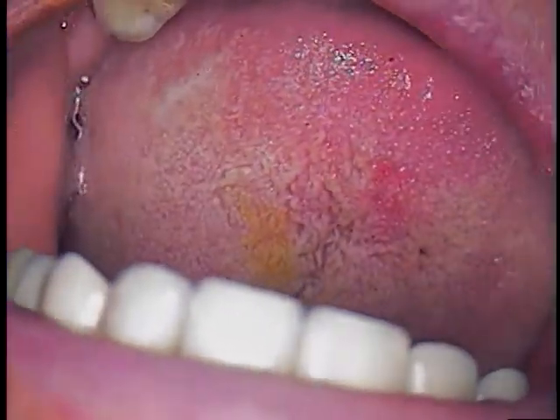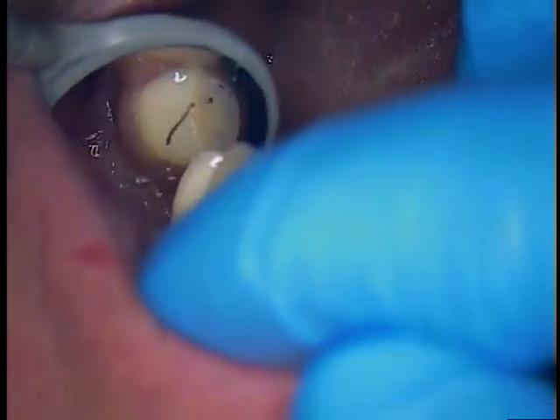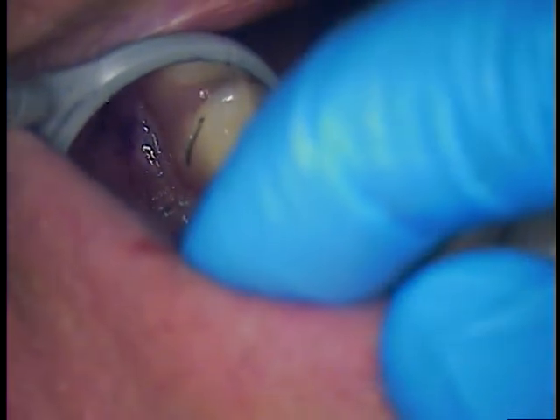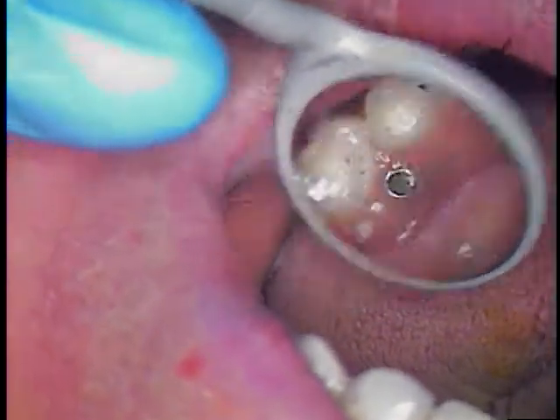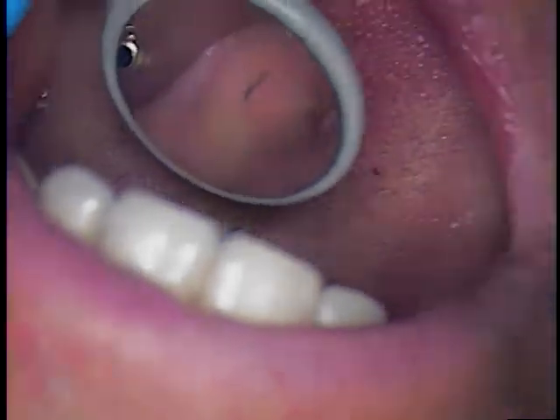On the side of 13, he had some that was fenestrating through the buccal fold, so I went ahead and made a small little drain and then sized it to the bone so that it would drain naturally. A little surprise, but maybe it's good that we were able to catch it now and put him on antibiotics.